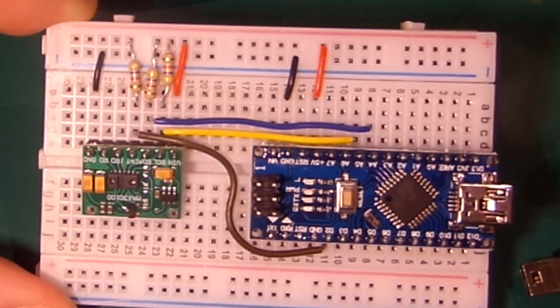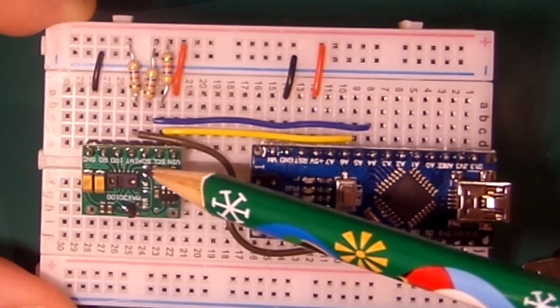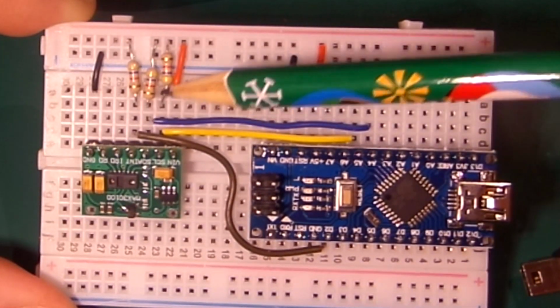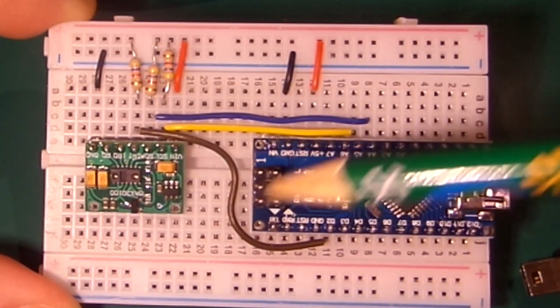I mean, when I say palaver, it was fairly simple. It took me about a minute or so, as I said, to take them off. Anybody with a solder iron can do it. Just apply a bit of the heat and they just pop straight off. It was easy, and you can see it was dead easy to do this. Each one just gets pulled up to 5 volts there, and that is it. Very simple circuit.